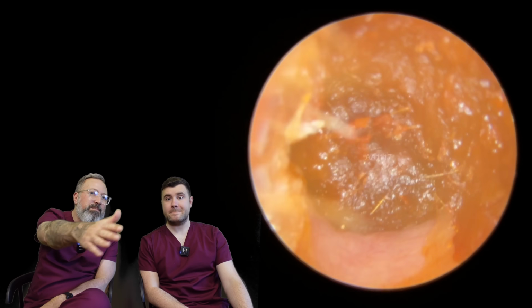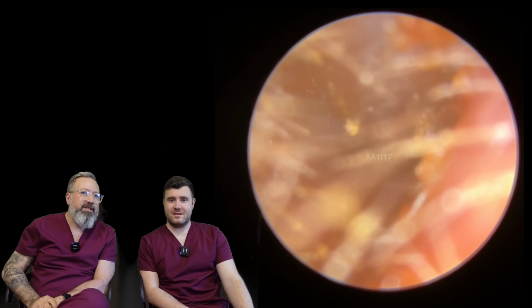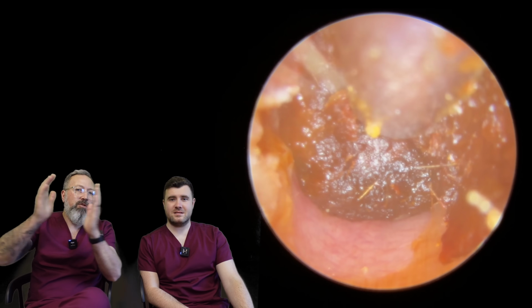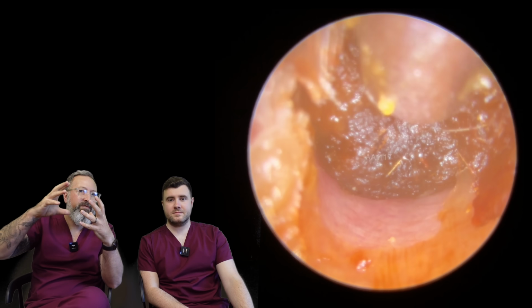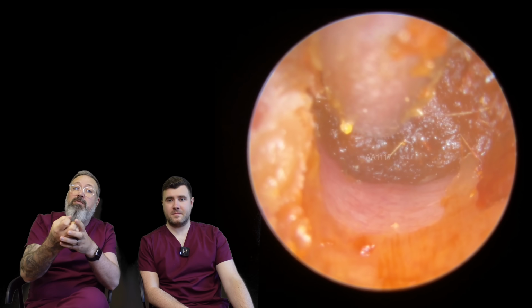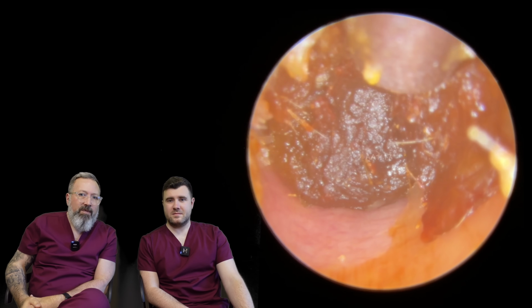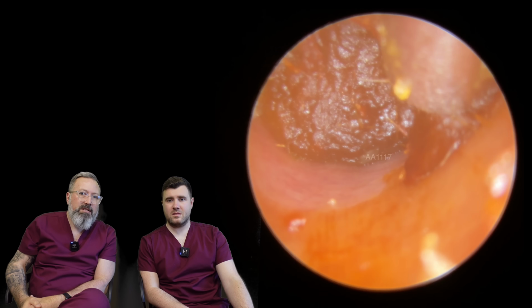If you get that lovely pink sheen to the canal wall there, you've got to be careful with these narrow canals. It's exactly that, I just put the suction tube in, and as I put it in, we could see the canal almost try and collapse around the suction. So you move that suction tube as quick as you can to create the gap. Otherwise, you end up with a vacuum in the ear canal, which is not particularly pleasant. So I've got this very thick, sticky plug at this point, so I'm just going to start taking some of the edges.